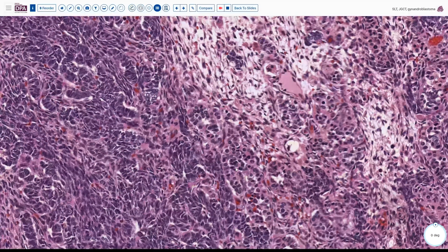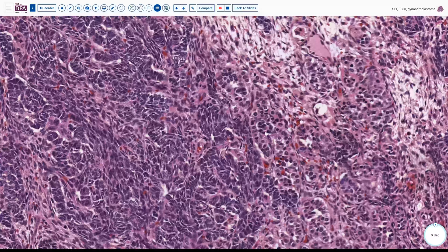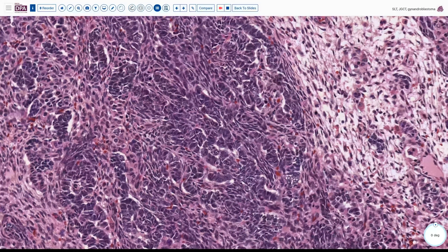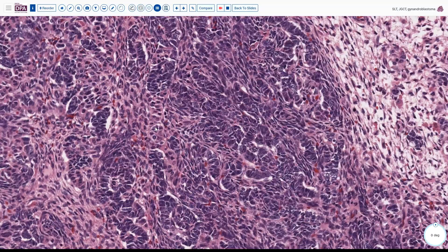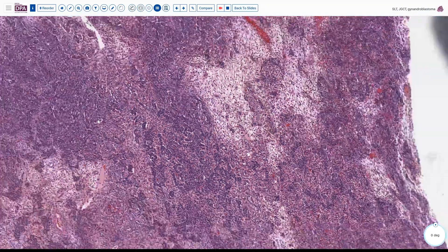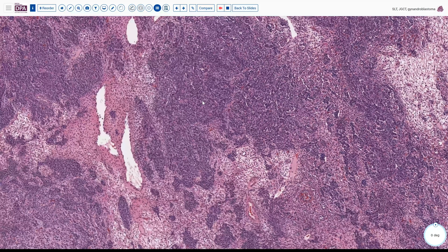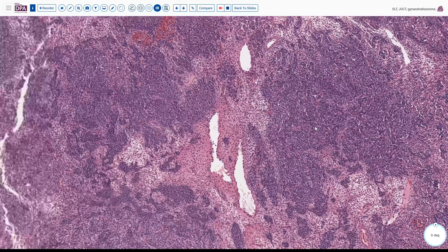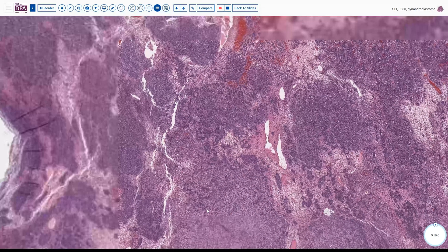We might immediately jump to the thought that perhaps this is a Sertoli-Leydig tumor. It has a stromal pattern and these mixtures of tubule-type cells and some more eosinophilic Leydig-like cells. There's even a suggestion of a crystalloid of Reinke in one or two areas. In a 25 centimeter tumor, we would be wise to examine it quite carefully because these can be quite heterogeneous in their appearance.